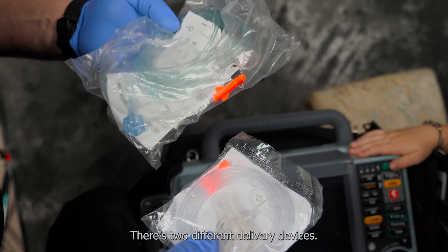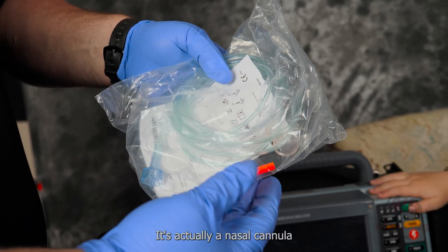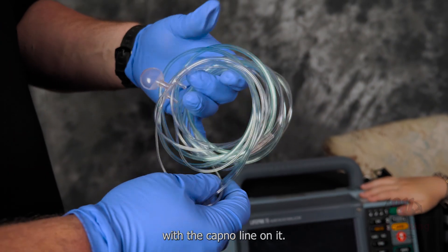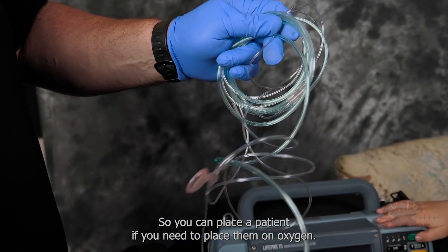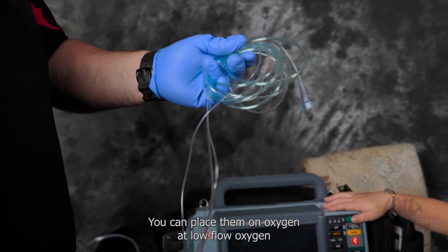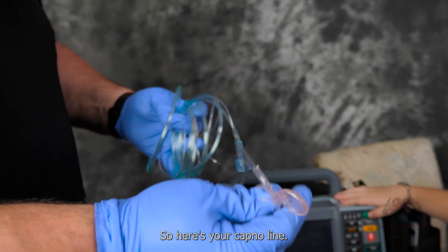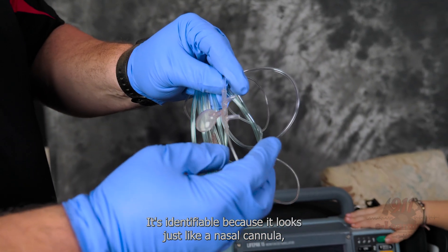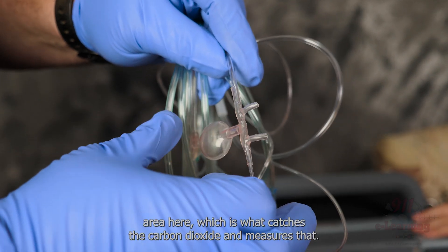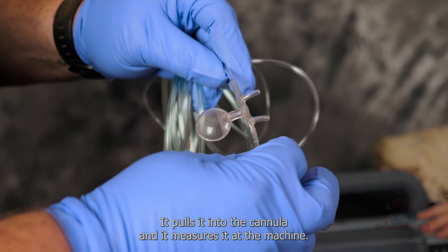There are two different delivery devices. This one is a nasal cannula with the capno line on it. You can place a patient on low flow oxygen and also connect the capno line as well. It looks just like a nasal cannula, but it has this area here which catches the carbon dioxide and measures it — it pulls it into the cannula and then measures it at the machine.